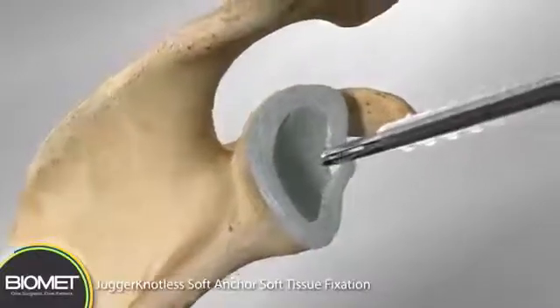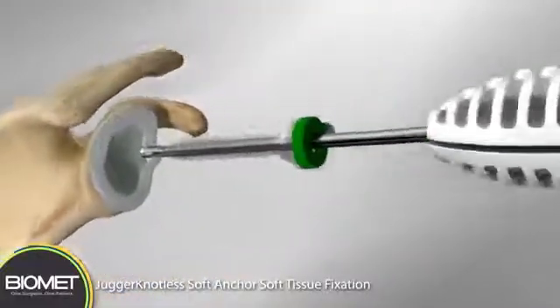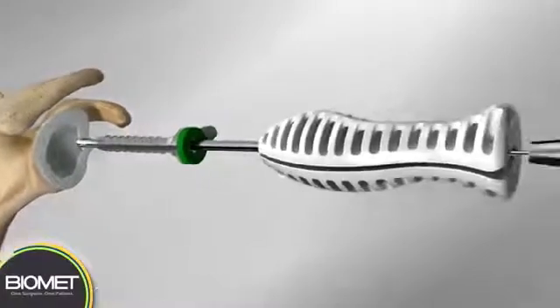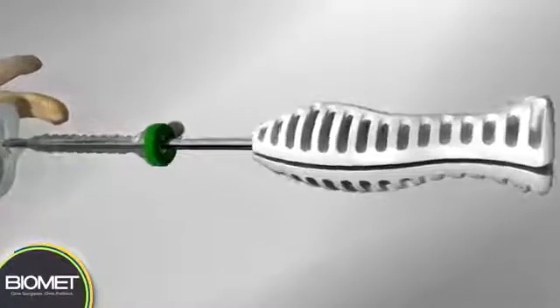Position the jugger knotless guide on the bone. Advance the drill until contact is made with the guide handle.